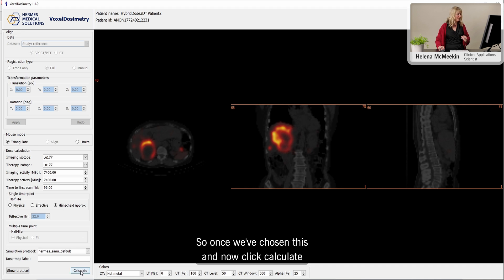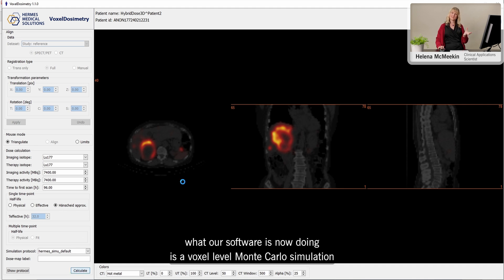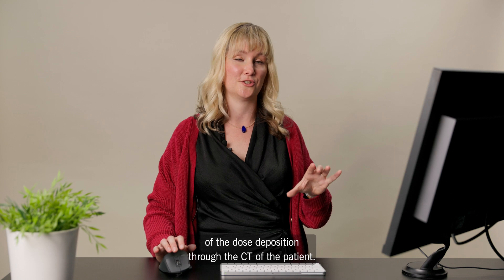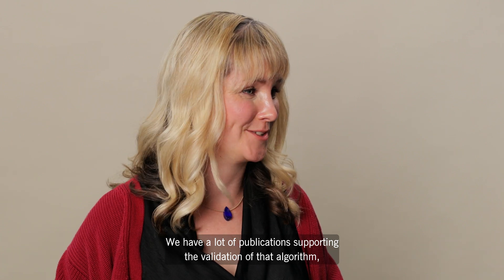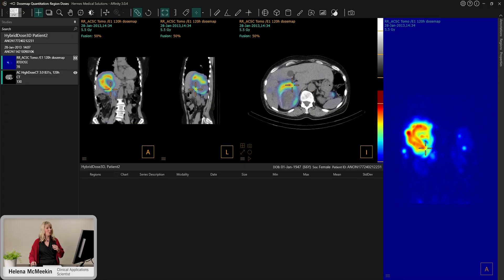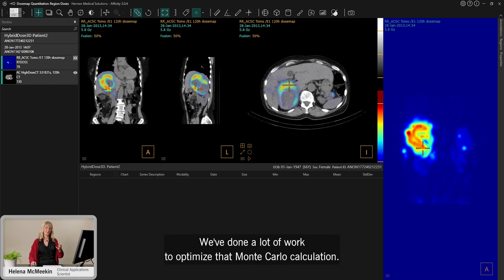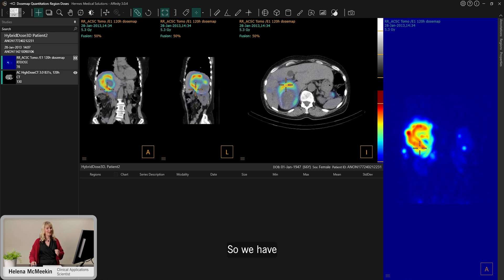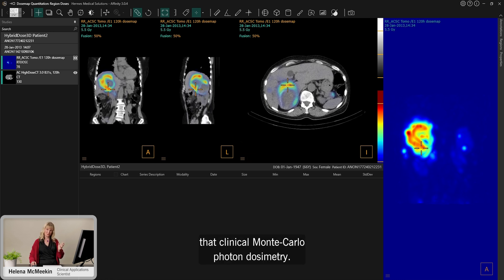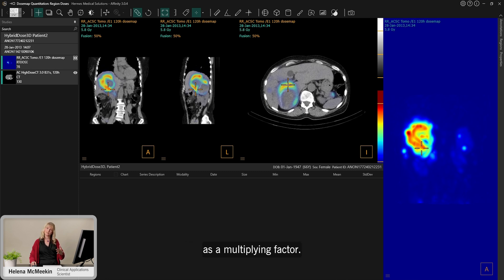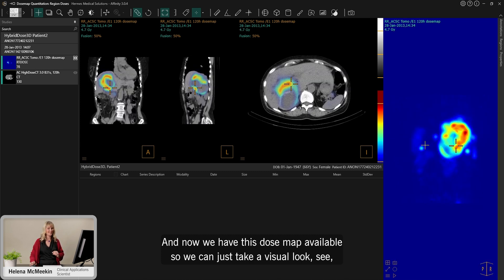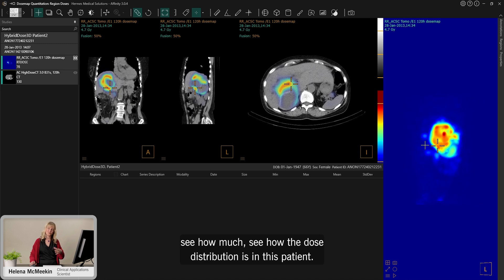Once we've chosen this, I click calculate. What our software is now doing is a voxel-level Monte Carlo simulation of the dose deposition through the CT of the patient. If you'd like more details on that, we have many publications supporting the validation of that algorithm. We've done a lot of work to optimize that Monte Carlo calculation so it's fast enough for clinical use. We have clinical Monte Carlo photon dosimetry; the electrons are treated purely as a multiplying factor. Now we have this dose map available so we can take a visual look at how the dose distribution is in this patient.